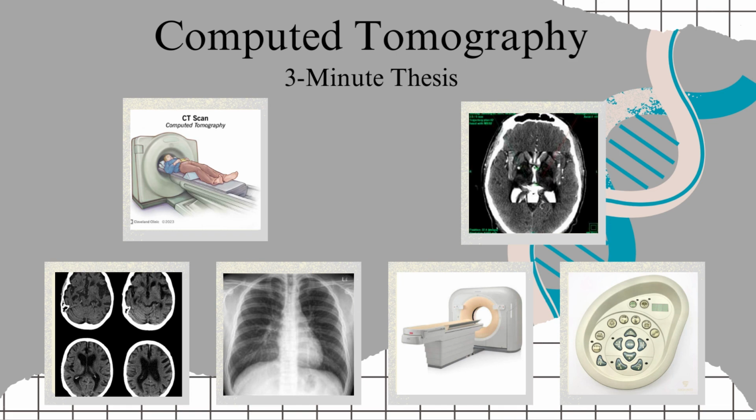CT technology has evolved over the years. Multi-slice or multi-detector scanners are now common, allowing for faster imaging and providing improved image quality.